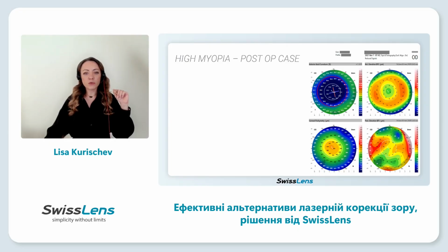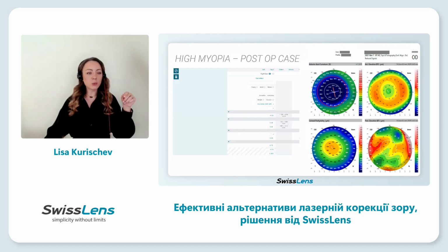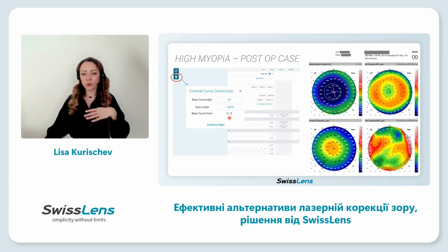We are working with millimeter and not dioptry. So for the calculation, we need to convert from dioptry to millimeter. This is easy. You can do it as well on our website. You can see here is our calculator. We choose just the flattest point and you write here the numbers and we get it in millimeter. But you can always change it on your device from dioptry to millimeter. It's actually also very easy.